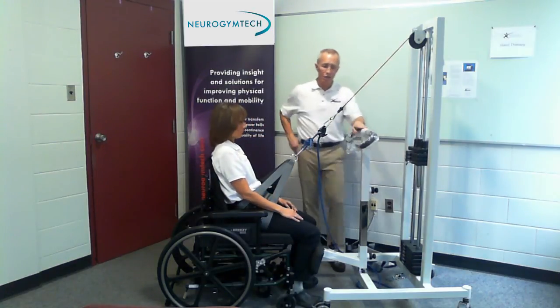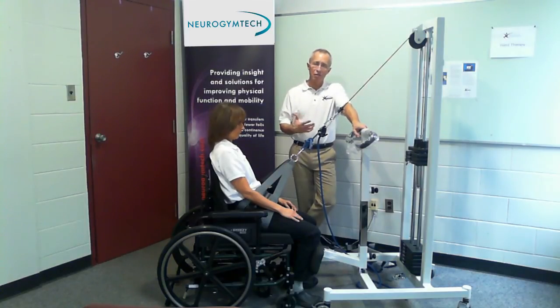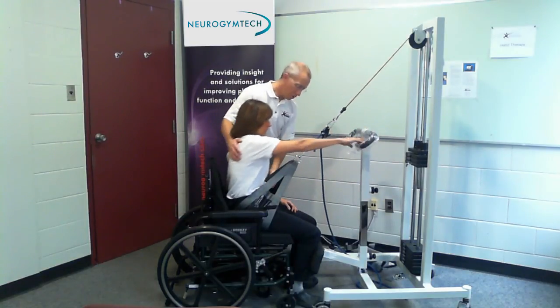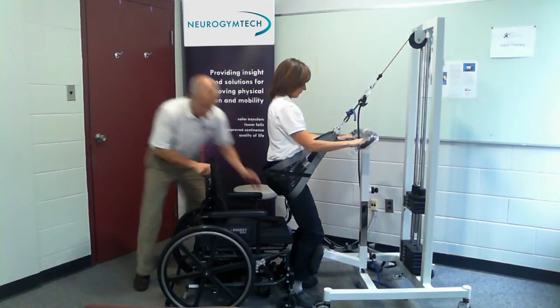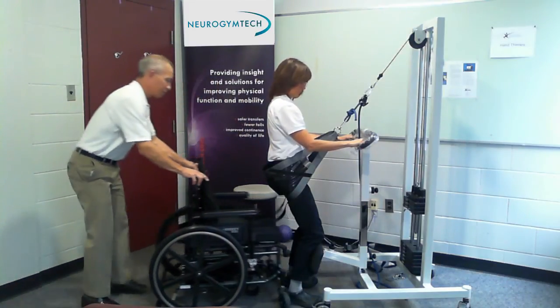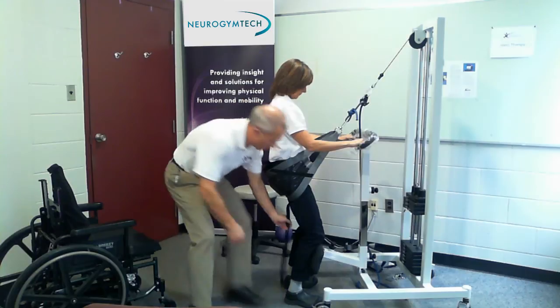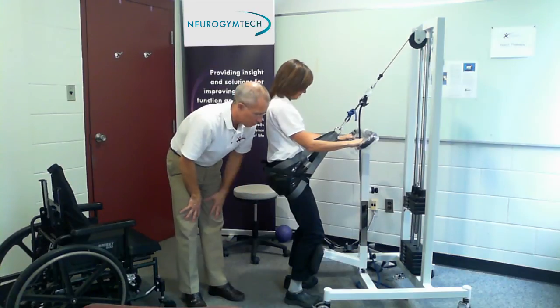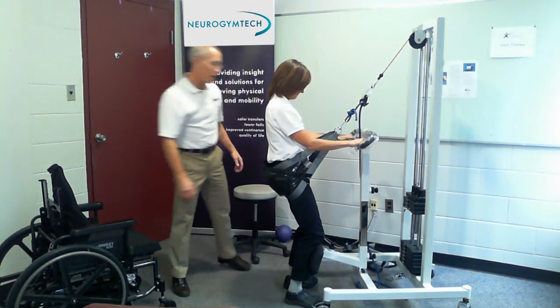The last application is teaching somebody to get up off the floor after a fall. When you discharge somebody, you hope they don't fall — but if they do, giving them the skills to get up off the floor could be a life saver. This patient is pretty high-level, they're walking around. Put your hands here and come on up, hold right there — I'm going to move the wheelchair out of the way and take the inner thigh straps and Velcro them to the side. You don't have to put the Velcro straps on while she's in the chair — only do it after she stood up. In this case you'll notice there's a potential for the sling to ride up.